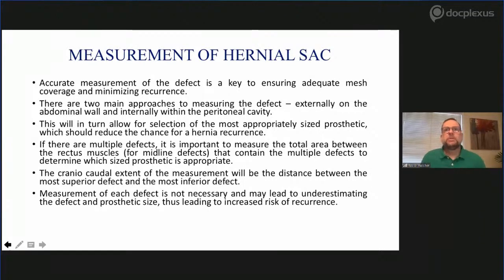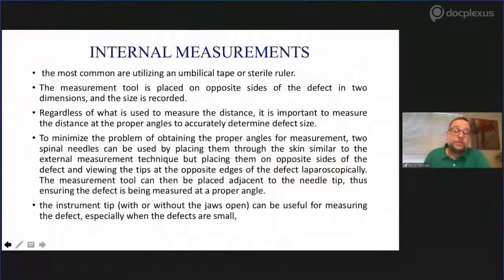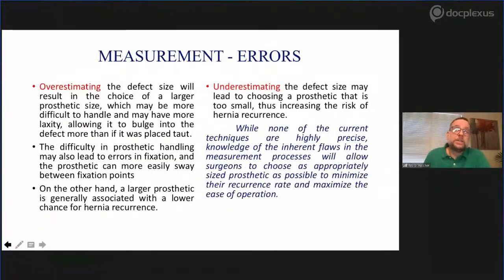I completely agree with the idea of the ratio of the mesh area and the defect being better than just a plain 5 centimeters overlap. I use 5 as my minimum overlap, and I try to always use a big mesh. 16:1 is really high, and it's hard to measure the defect area because the defect is not a simple geometric form. It's not a square or ellipse or a circle. So it's kind of difficult, but anyway, I like the ratio idea.